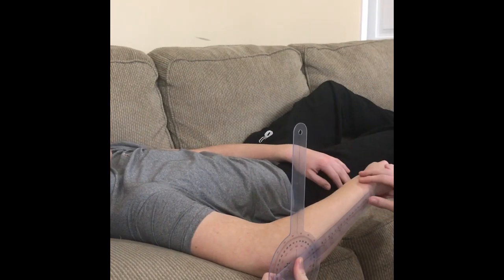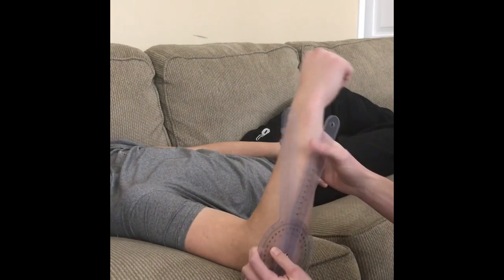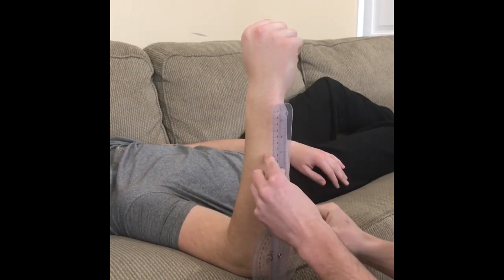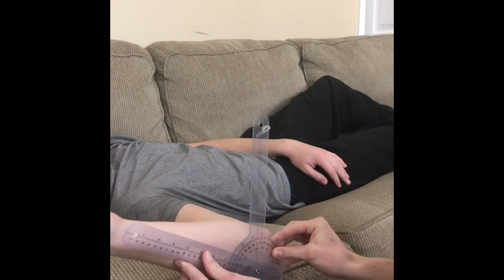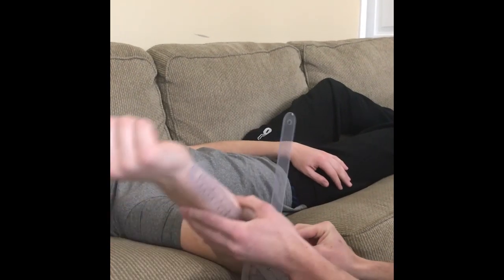Is that as far as you can go? Sure. All right, then there's 70 degrees of movement there. Bring it back to the center. Make sure they recenter their arm. And you can go ahead and flex it for external rotation. Right there. Make sure you're following the perfect vertical. And you have 65 degrees of motion in that direction.